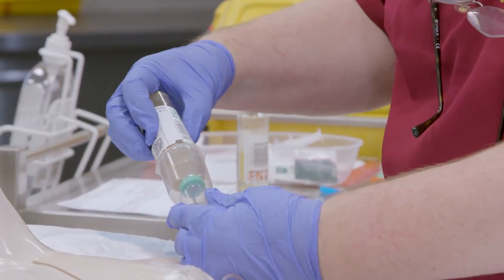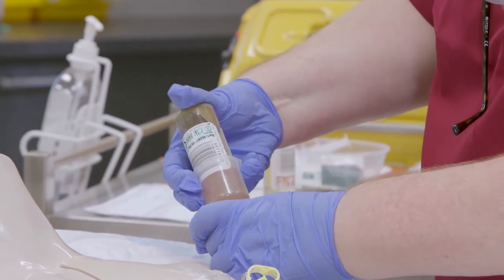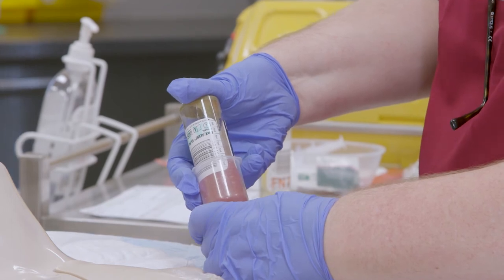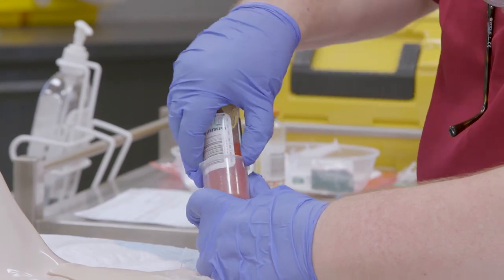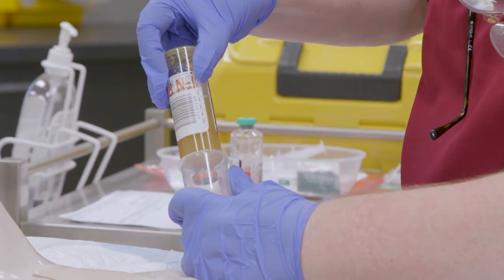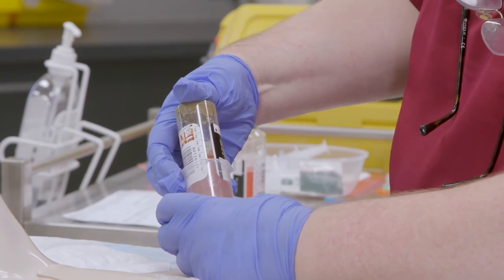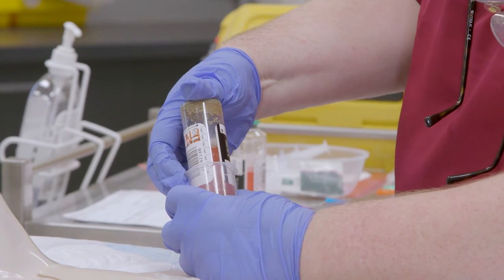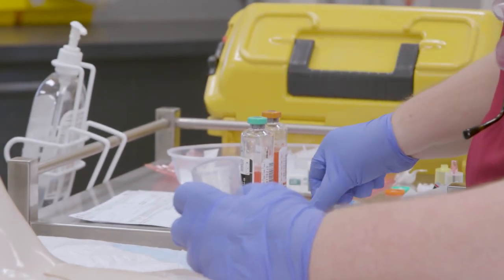And now we can collect our first aerobic blood culture. We need to collect a minimum of 10 mLs. If you collect more, that's fine. Just keep an eye on your external measurement there on the bottle. Once you've collected enough, remove, collect your anaerobic in the same fashion, and just collect in your order of draw.